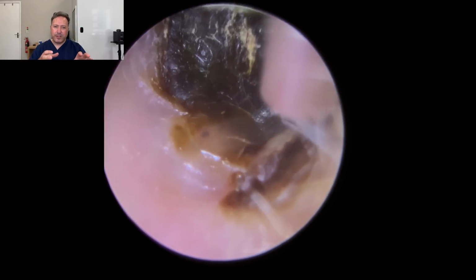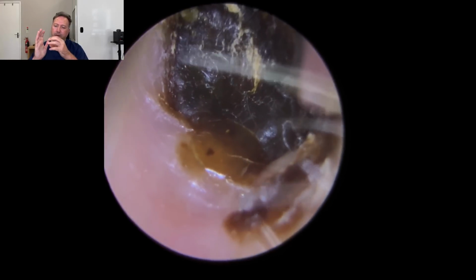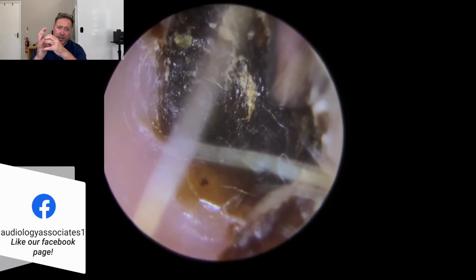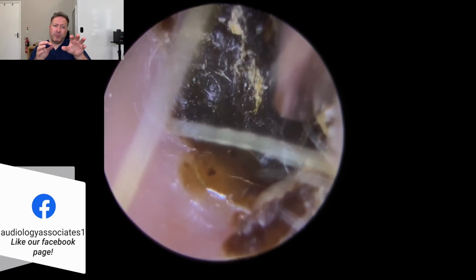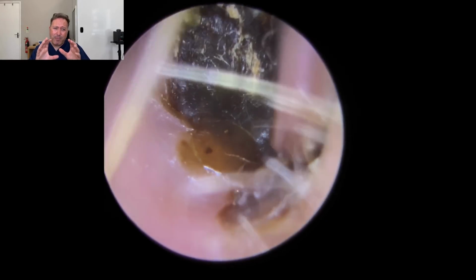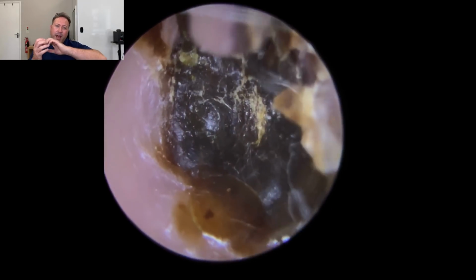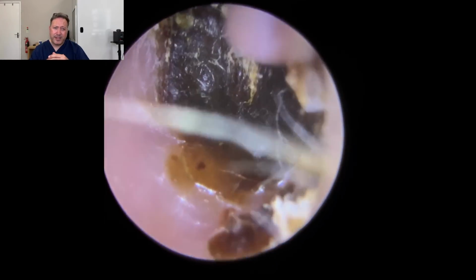Now the difficulty we have here is that when we're trying to remove this type of wax, if you held the suction tube in the center of the wax here, the sides which are dried onto the canal walls are going to hold that in, so you won't get the suction grip to be able to pull that out. But what you can see I'm doing here is just slowly working around the outside edge, looking for any gap or any bit of play, if you like, in the wax, so we can lift those edge pieces off the canal first and then very slowly peel those back so we can take this center section away.